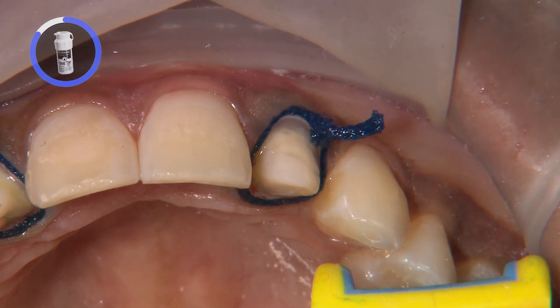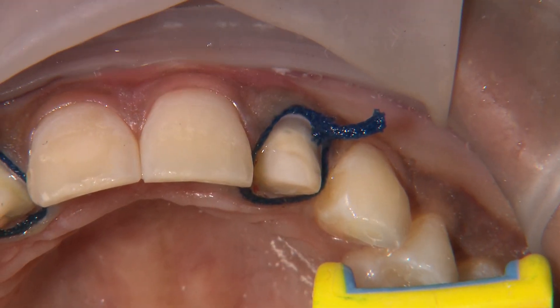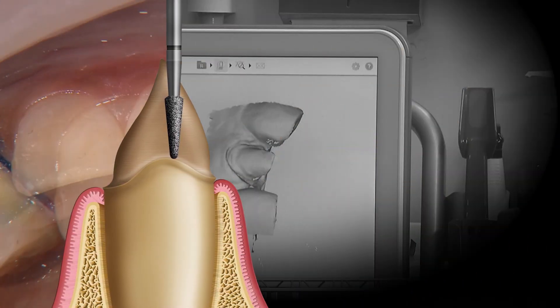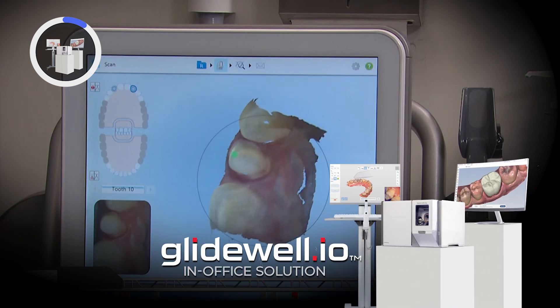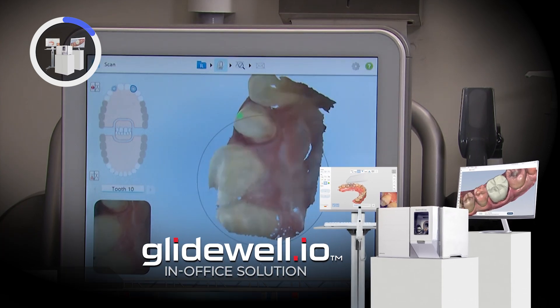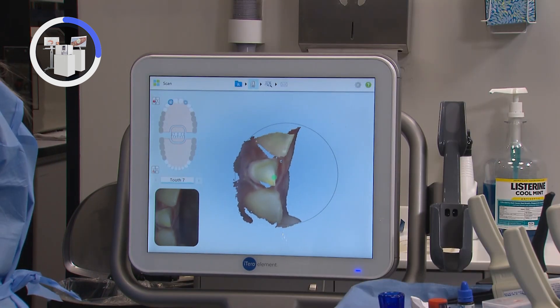Any excess fluids on the preps or within the sulcus can certainly create distortions within the impression. We first capture a high-resolution image of each prep, then the rest of the neighboring teeth in the upper arch, the opposing arch, and then we finish with the patient biting together to establish the occlusion.